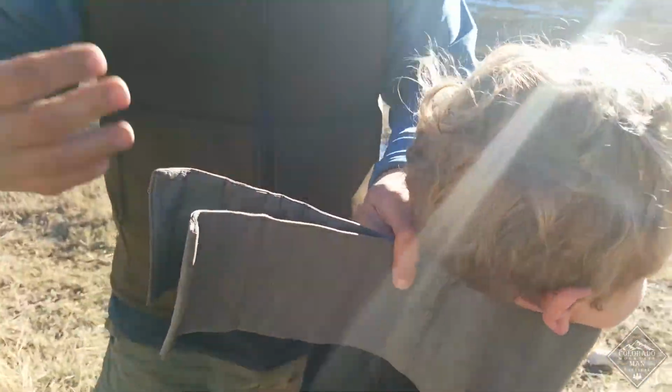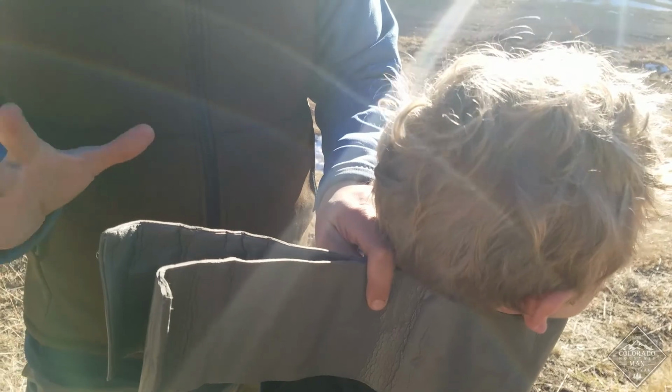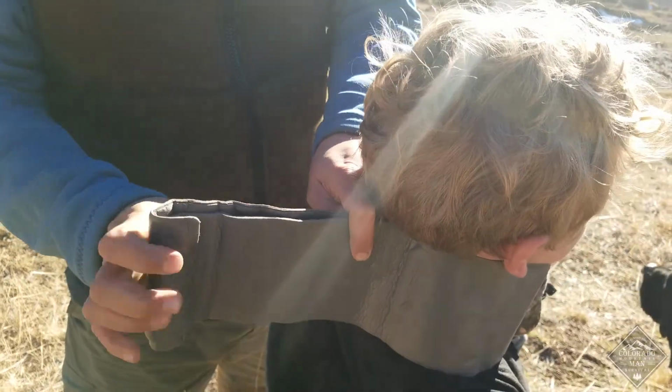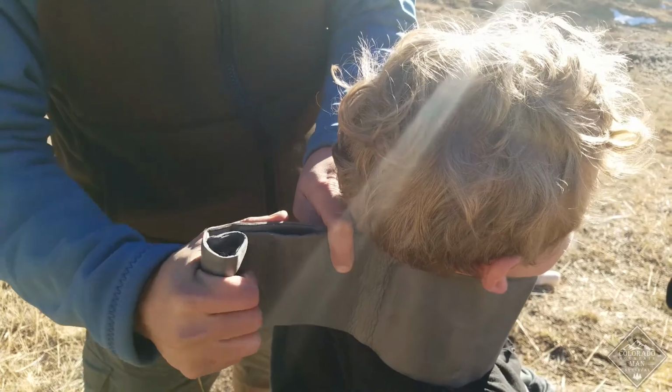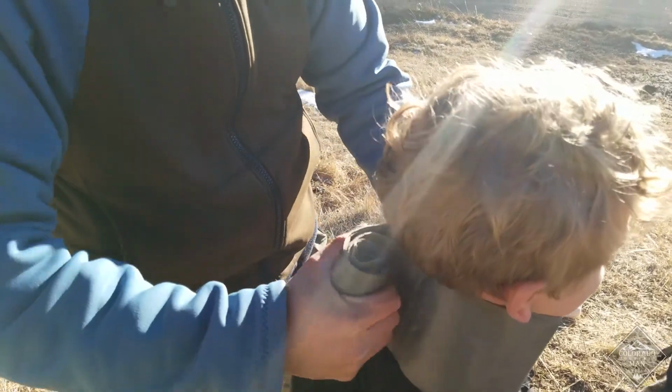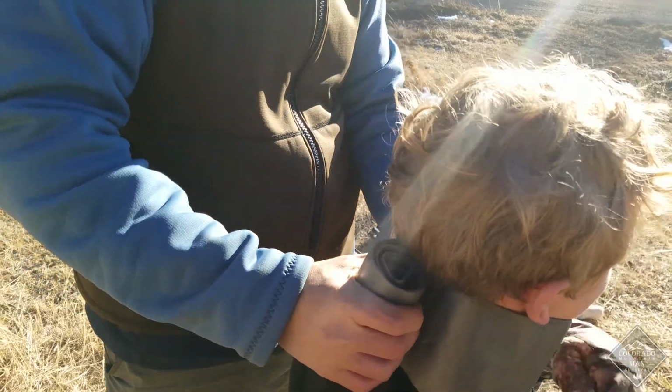So some people will complain about these. These are not a comfort device. It's not a massage device. It's really uncomfortable. So uncomfortable is one thing, in pain is another. But if they're a little uncomfortable, just tell them it's better than being paralyzed, right? So I'm rolling this down here. My jaw is in pain. Down. Like right here. Oh.